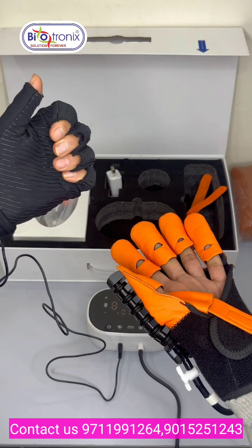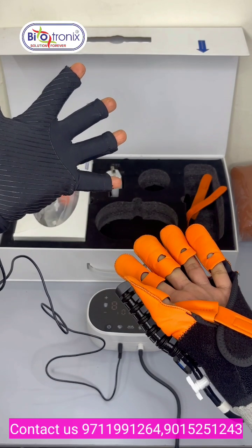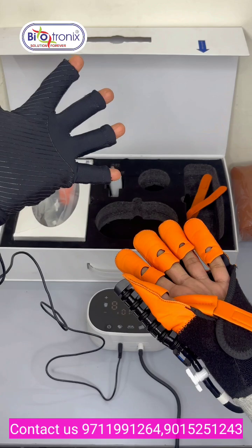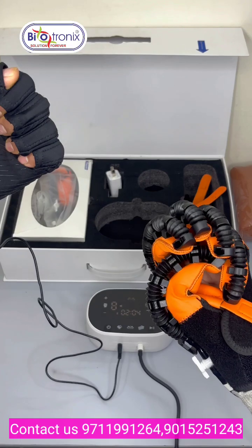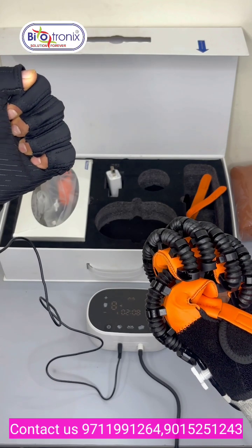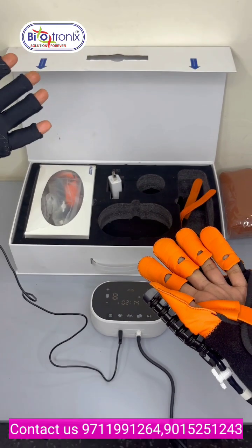I'm flexing the same again, then extension. I am holding for a while, so the same will also remain flexed. Same will also remain extended. Now I am flexing the same and holding it for a while. So whatever I perform with the data glove, the same will be repeated in the rehabilitation glove. So this is the mirror training mode.